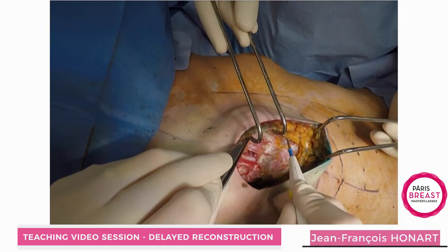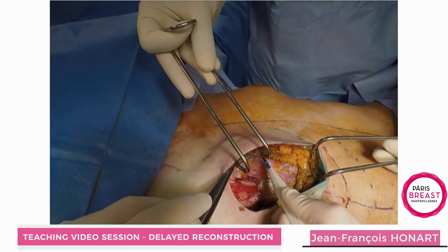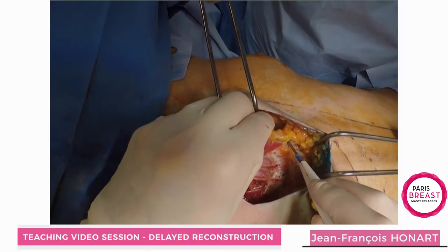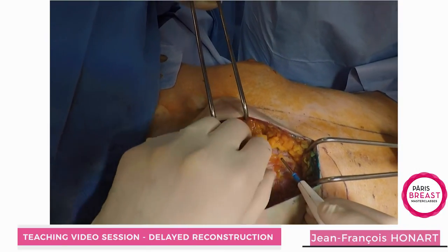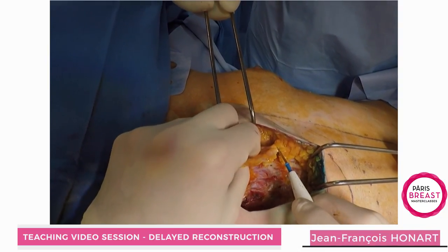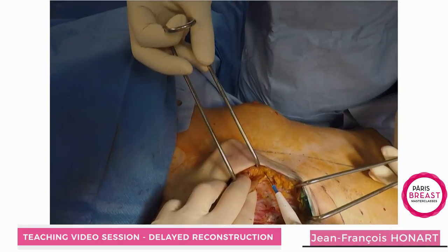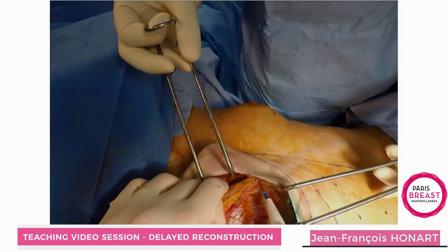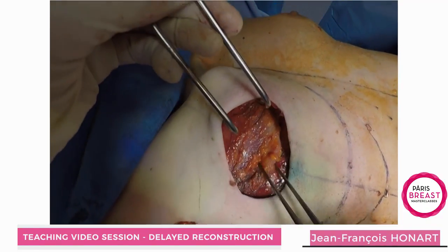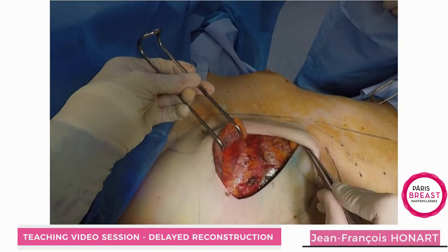You have to go as far as you can to create the space, and you want your expander to sit at the inner part of the breast. You cut the lower insertion of the pectoralis major, and after doing this you will raise the fascia of the serratus.